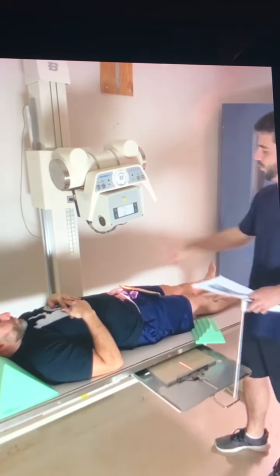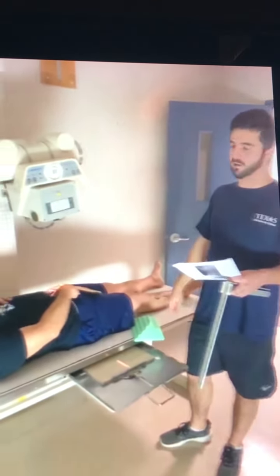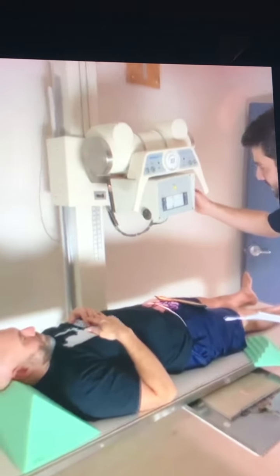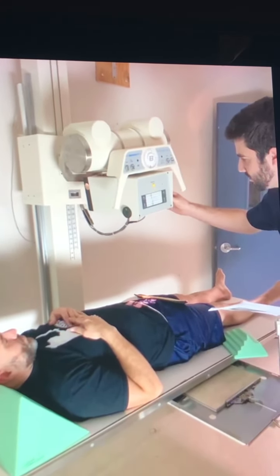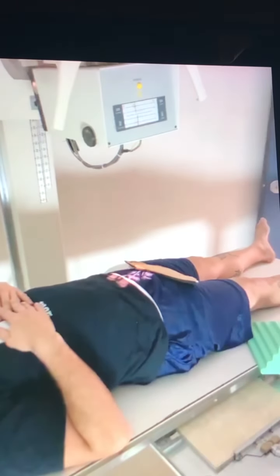You want them to point towards their pubic symphysis, and you're going to be 2 to 3 inches above. Good. You want to collimate it down to 5 by 6. So it's pretty small. And that is an AP coccyx.